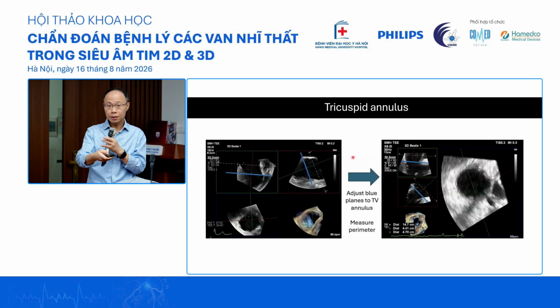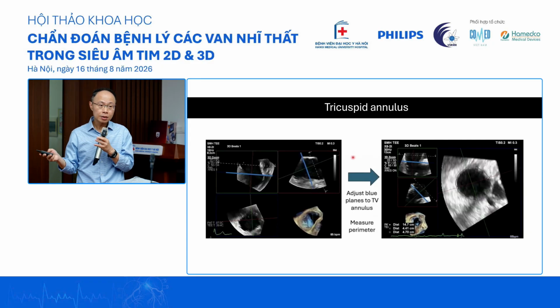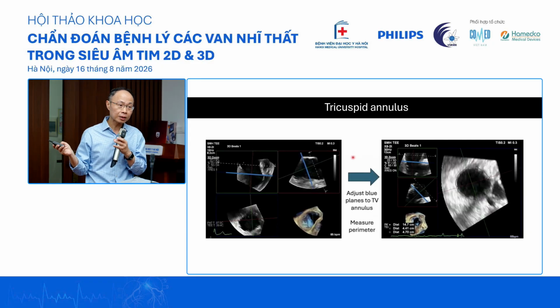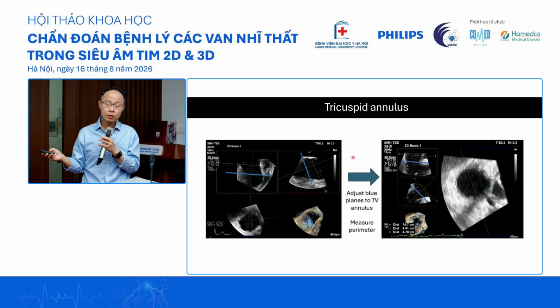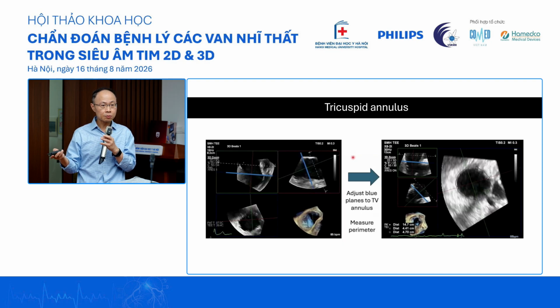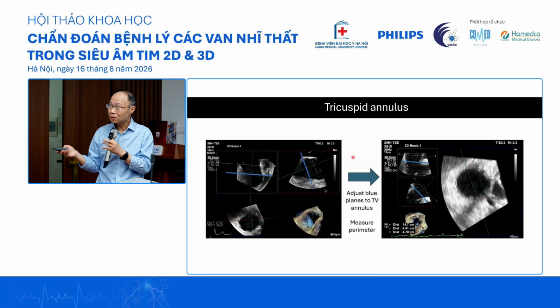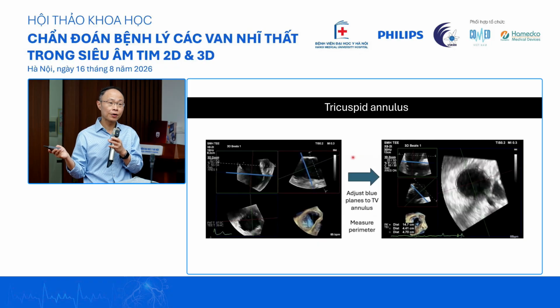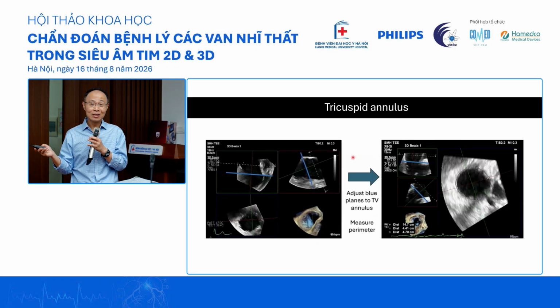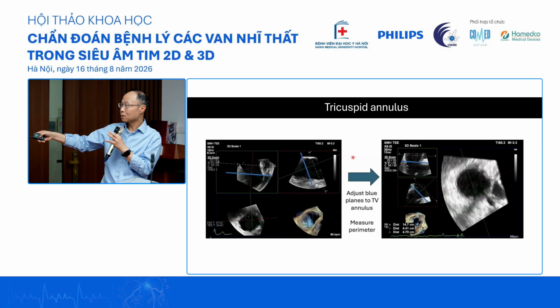Just now, I think the previous speaker spoke about the tricuspid annulus. From the point of view of tricuspid clip, this is really important because the normal tricuspid annulus is about 28 to 32. Sometimes we see 36, but 40 is about the upper limit. If you scour through PubMed, you'll find people who clip a 50 annulus, but I think usually 40 is the comfort zone.